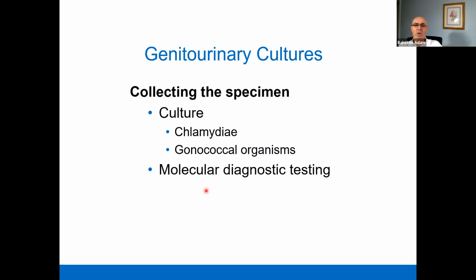Genitourinary cultures are the third common type of cultures that we perform in clinical microbiology. The way we culture is based on the agents that cause infections.